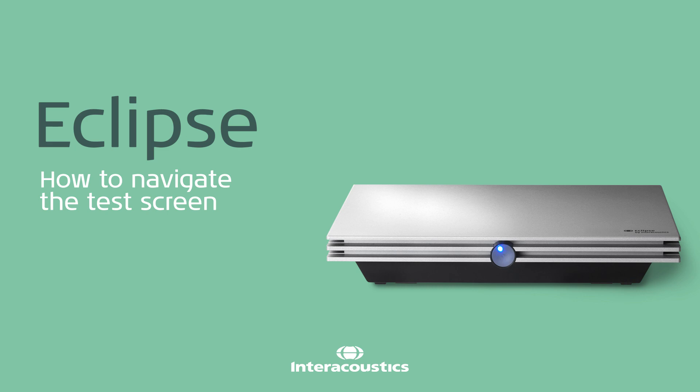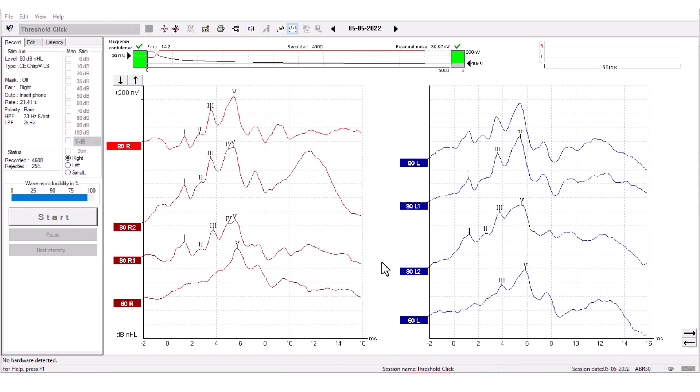How to navigate the Eclipse test screen. This is how you navigate the Eclipse test screen. The test screen is where all your waveforms are located.